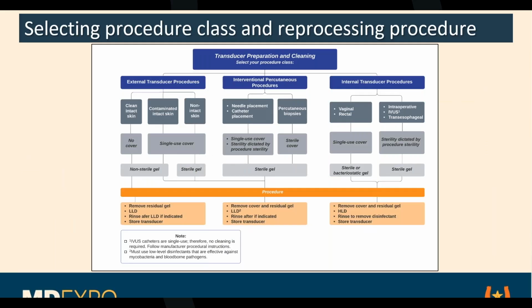This is going to shock some of you. I've given this talk to sonographers, and they don't always read the instructions for use on devices. I see some smiles out there. Yeah, so that's one thing to make sure, but you should absolutely, when a system that can kill a patient, basically, is going to be placed into service, be the ones that say, this is what we need to do.